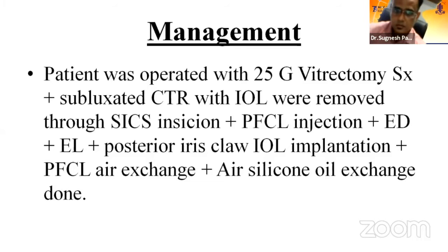So the patient was operated with 25 gauge vitrectomy surgery. The subluxated CTR with IOL were removed through a SICS incision. PFCL injection was done, endodiathermy done to the break, and endolaser done. The posterior iris fixated IOL implantation was done.